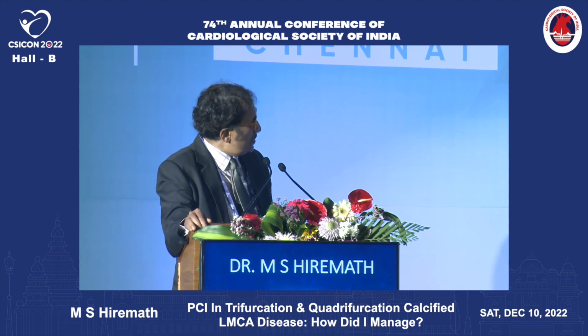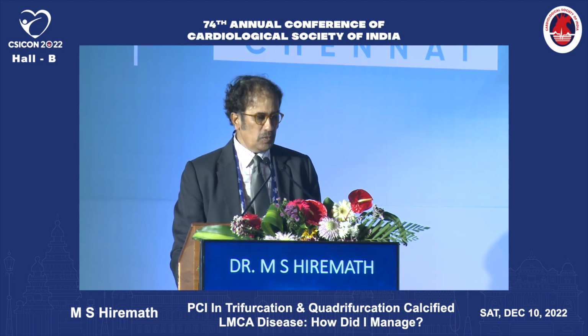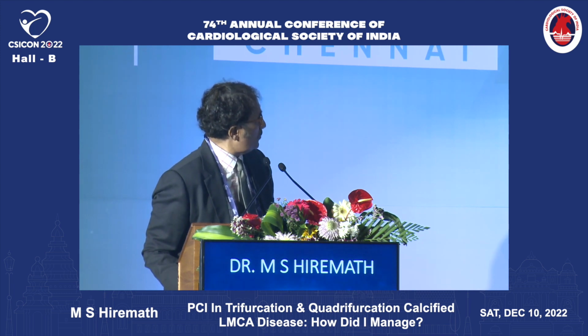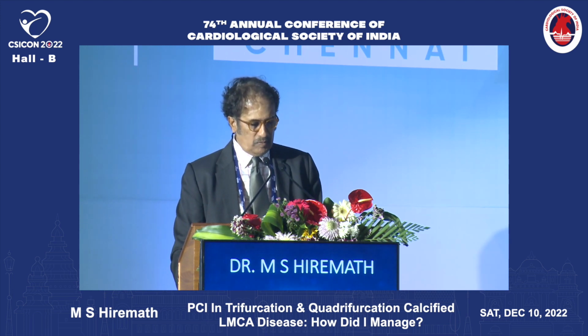decisions. So this is a critical LAD lesion. This was stented, but you see in addition distal left main, proximal portion of the OM, and proximal portion of the LAD, question mark. So here we have done FFR to circumflex, which was abnormal, then FFR to LAD, which was also abnormal, and that means we have problems at the distal end of the left main, or the proximal LAD and proximal LCX.